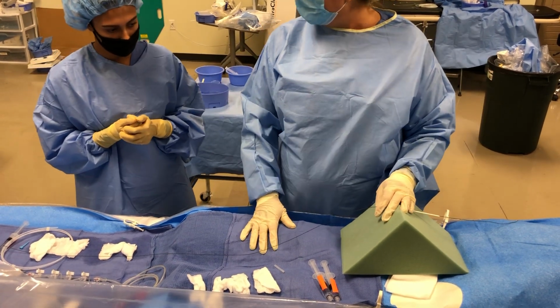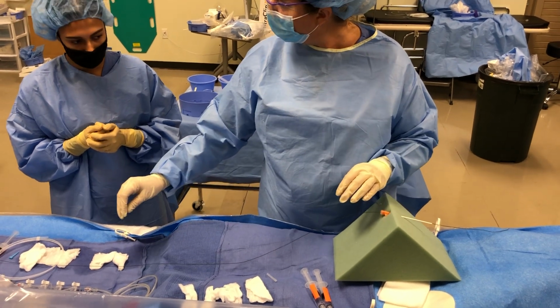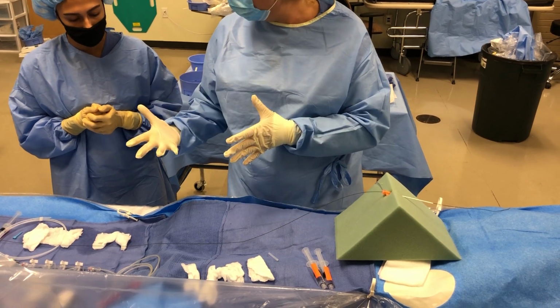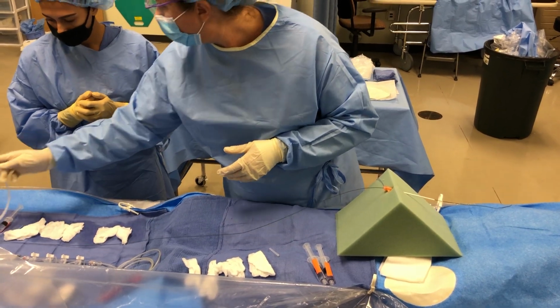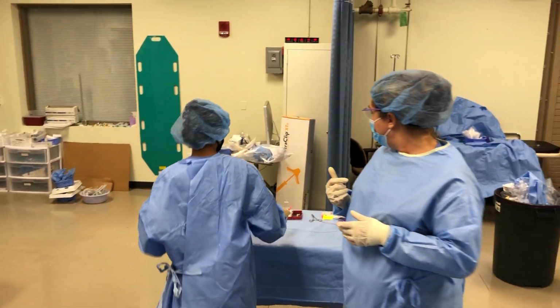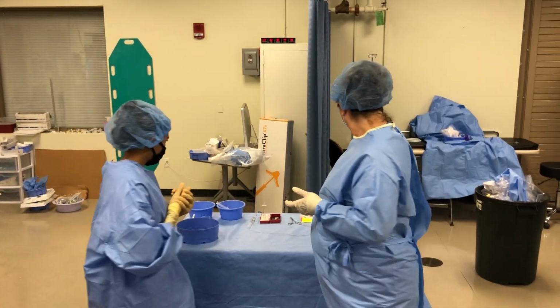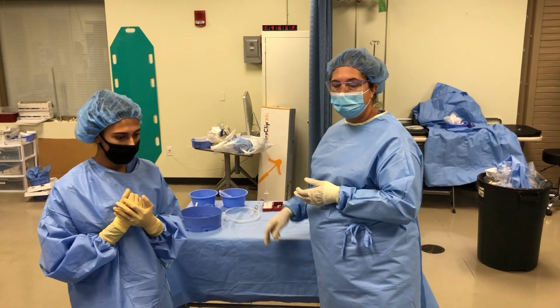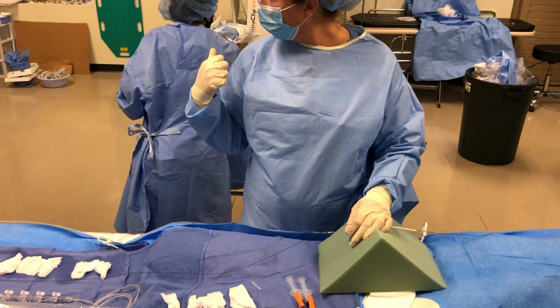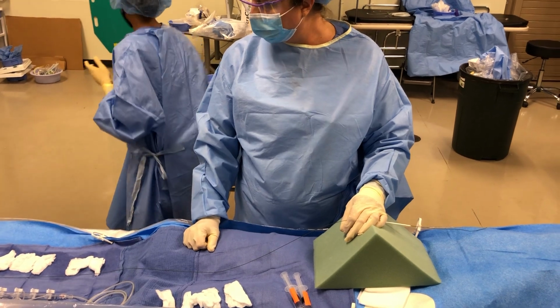Okay? Now, some doctors will actually have you go ahead and take the long wire out along with the dilator. We'll wipe it and wrap it in a loop, which I'm going to teach you a little bit later. You would go ahead and get rid of this, onto your back tray. I would probably even throw that in the garbage. If I had time and I had a garbage close enough, you'll just toss it, get your blade, put it back. And even anything like that, put that in your garbage bowl, okay?